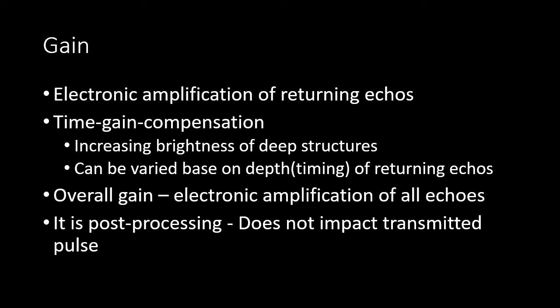Remember, gain is a post-processing technique. It does not impact the transmitted pulse, where power is like a pre-processing technique where you are increasing the amplitude of the ultrasound waves that you send out.